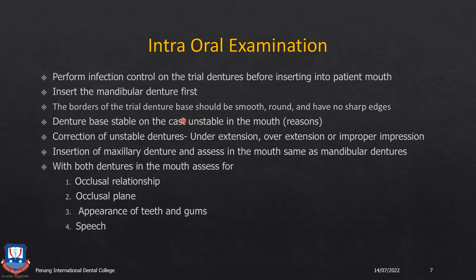Then the upper denture is inserted, and similarly the upper denture is checked for the peripheral extensions, the retention, and the stability of the denture. All these things are verified in the maxillary denture. Then finally you verify your jaw relationship, whether it was recorded accurately, by verifying the centric relationship, the vertical dimension of occlusion, the vertical dimension of rest, and Silverman's closest speaking space.